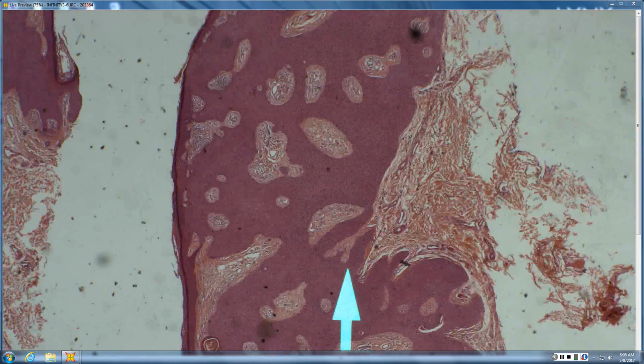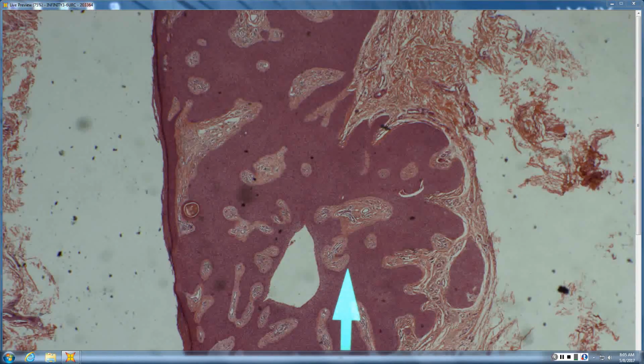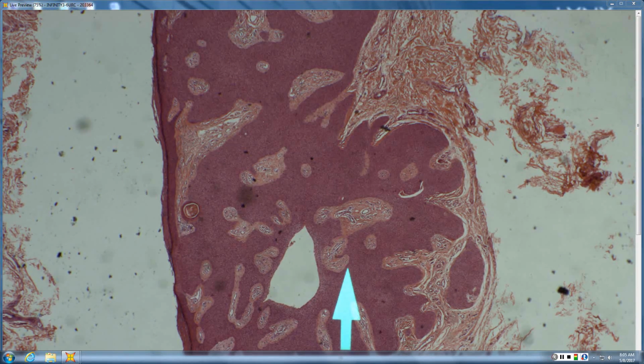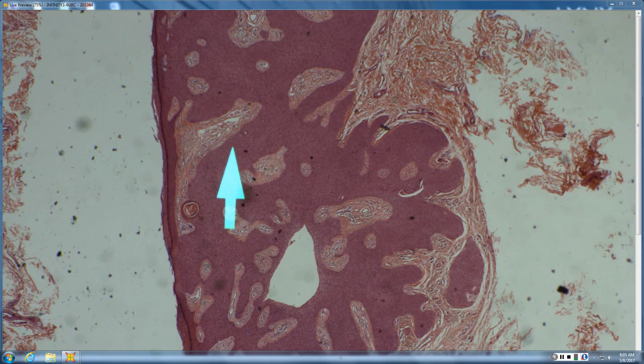Looks like we got another poroma. Looks like a poroma. You deserve the easy button for that because you nailed it right at scan. So that was easy. So why poroma? You got these pink cells kind of hanging off the epidermis. They're about the size of acrosyringeal cells, so they're smaller than epidermal cells, about like the eccrine duct. You have these little circular white spaces, which is duct differentiation, and they never palisade.